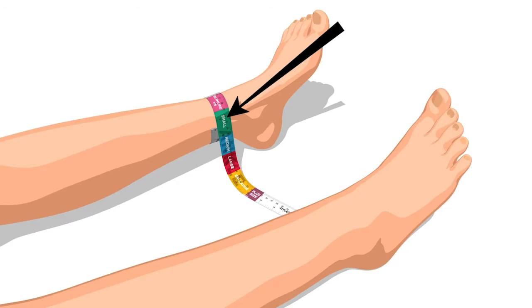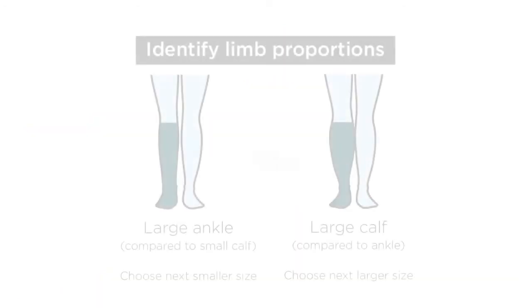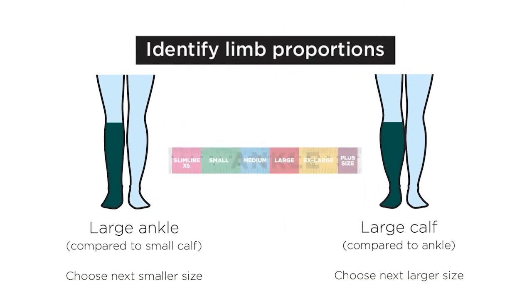The patient's legs should be observed to see if they are in proportion. Should one leg appear larger than the other, both should be measured, as there may be a need to fit 2 different size stockings. This applies to the calves and ankles.